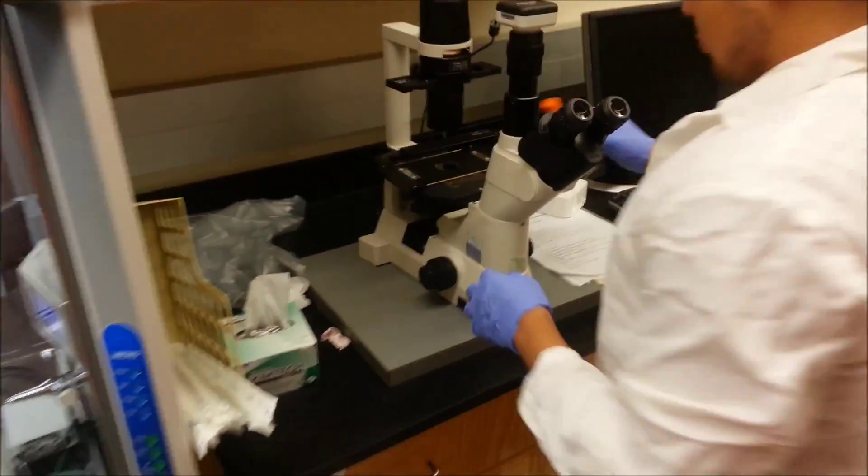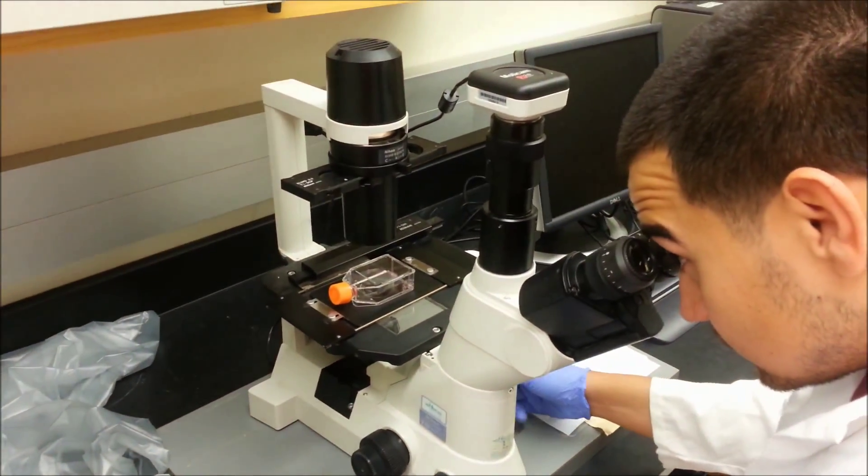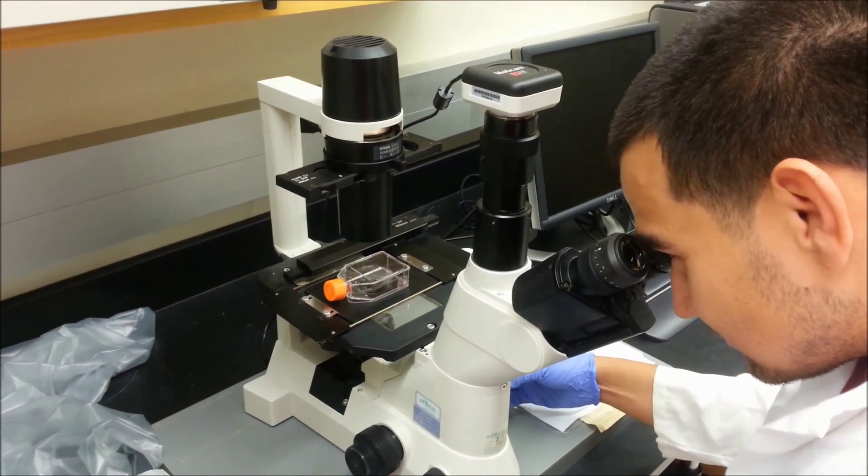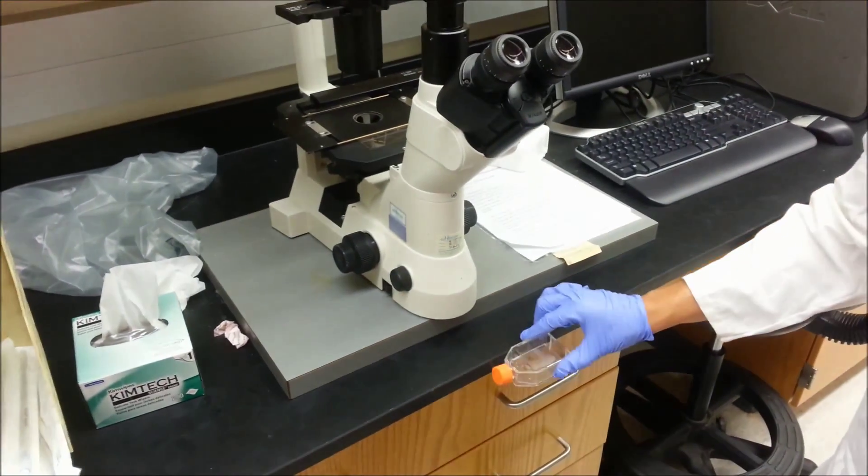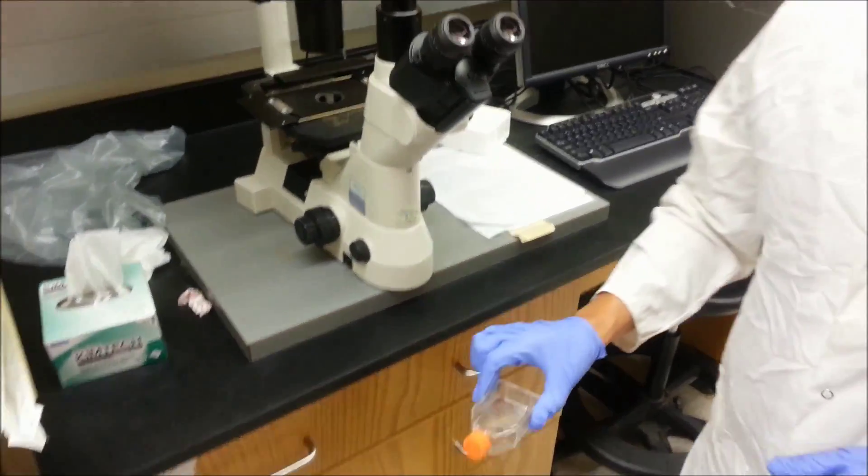Check the cells under the microscope again to ensure that they were not removed along with the trypsin. Tap the flask against a hard surface to dislodge the cells.